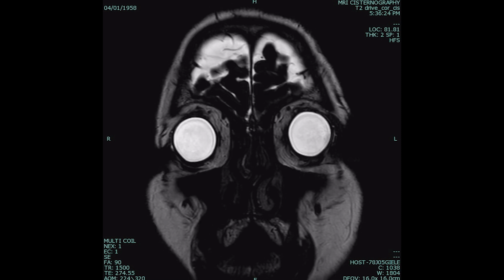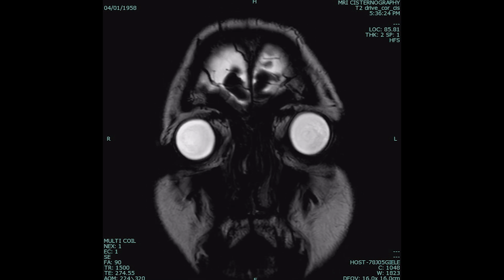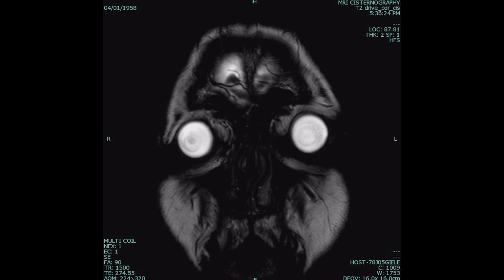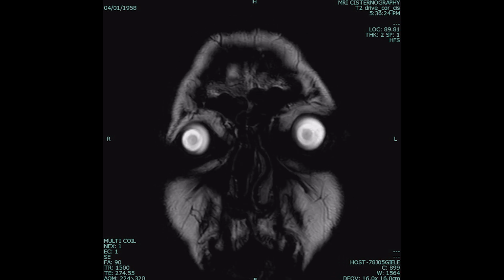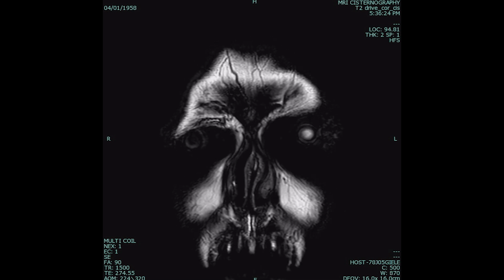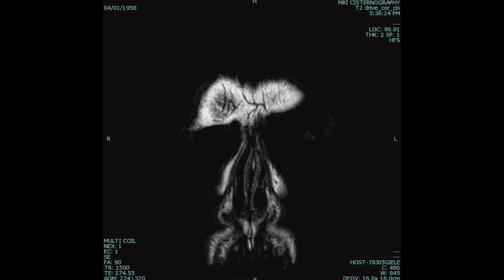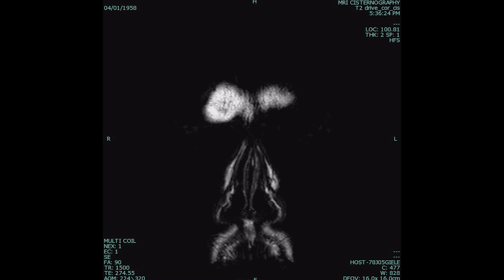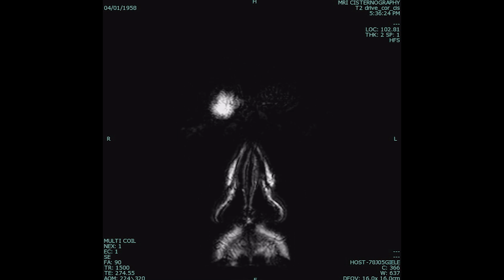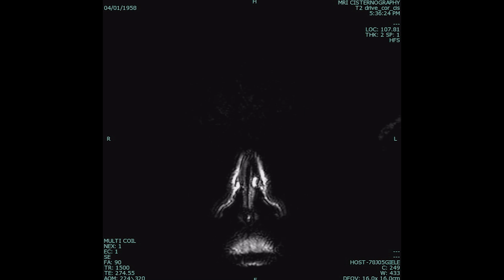The plan here is to take this patient for surgery, do a full ethmoidectomy, anterior and posterior, and antrostomy and a sphenoidotomy to identify the skull base in total in the left side, and then proceed to a middle turbinate resection to be able to not just identify the defect and the meningocele clearly, but to also create a nice and flush bone bed for our graft to be placed.